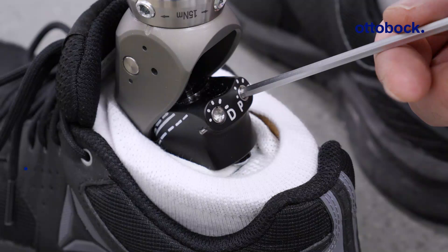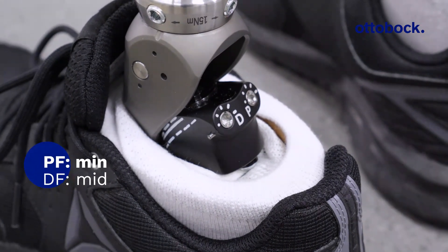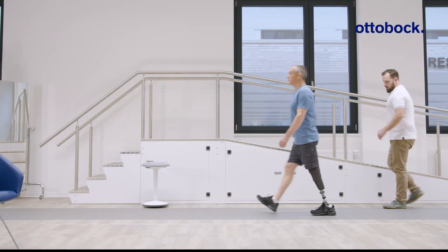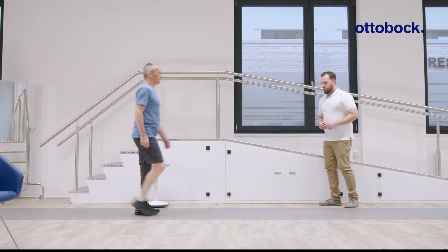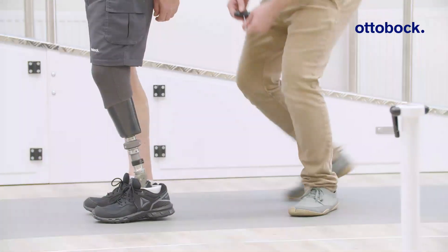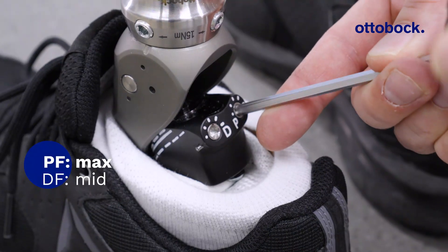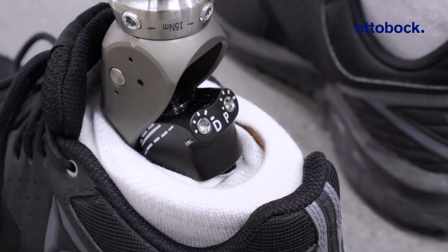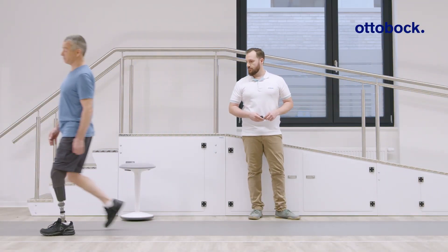Setting the plantar flexion resistance to minimum will lead to a very quick foot-flat and insufficient forward progression of the center of mass. By comparison, setting the plantar flexion resistance to maximum will lead to a stiff heel behavior, which will overly encourage knee flexion and a greater propulsive effect.